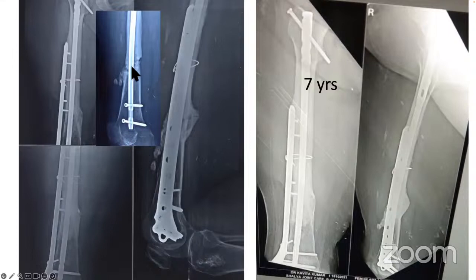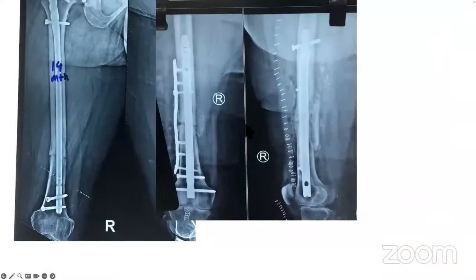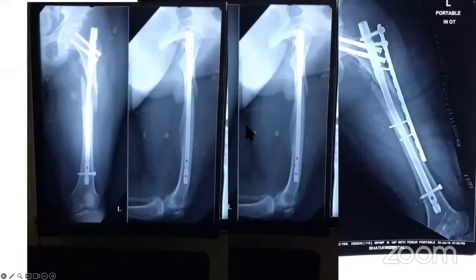If you're doing a distal femur nail, then probably maybe all right. But for safety's sake, with a distal femur or an antegrade nail, you can put in a plate and then you are almost 100% sure this is going to heal up. All these are the ones, typically a massive number of non-unions, seen in these junctional fractures. Or this sort of an oblique fracture approximately. This also goes into non-union. So ultimately it is treated with the adjuvant plate.